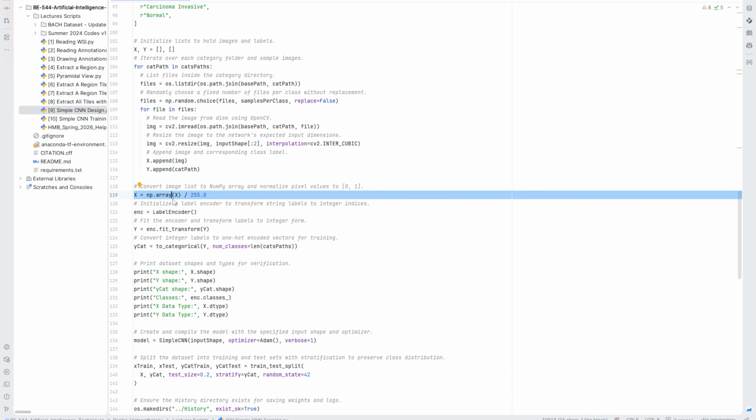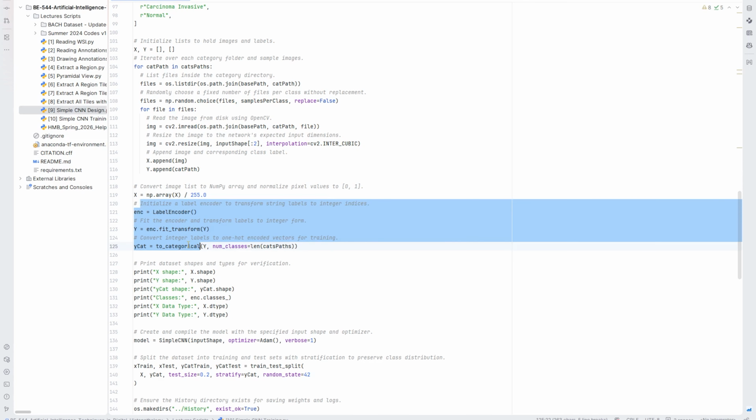And imagine that we applied it on the wide range, which ranges from 0 to 255. Then inside the architecture itself, it will deal with those large values, accumulating at the end of the architecture with a very large value, which may overflow your memory and give wrong results. So here, if you are dealing with images, it's recommended to normalize it by simply dividing it by the maximum value, which is 255. Then we are applying encoding.